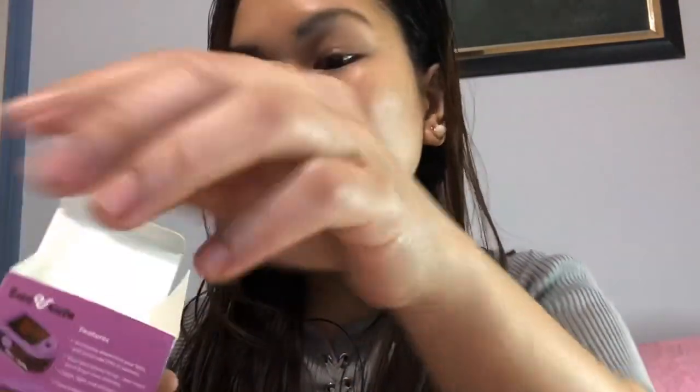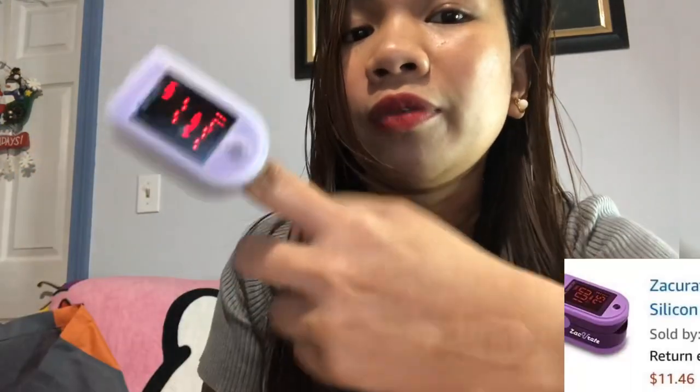It also has a string that you put through it so you can carry it. I need to assemble this — maybe tonight or tomorrow. It came with a free battery. Let me try if it's working — just pull out the tab and put the battery in. Let's see if it's working. Just open your finger and put it in. There you go, there's the result: 97, 82. I'm normal! I have a cold and I'm taking antibiotics, so maybe that's why it's not 100%.